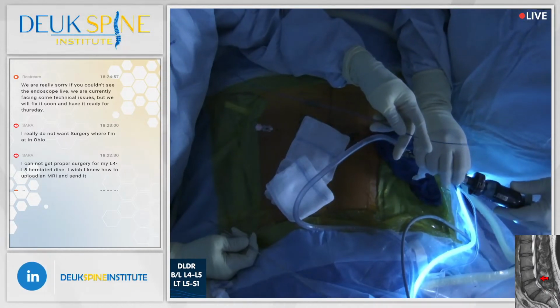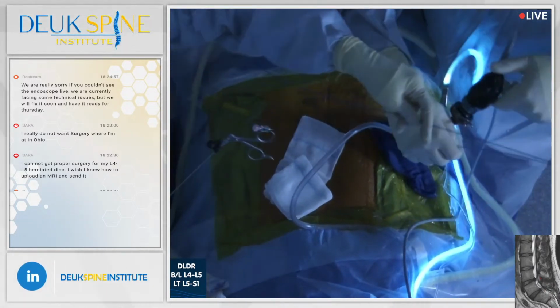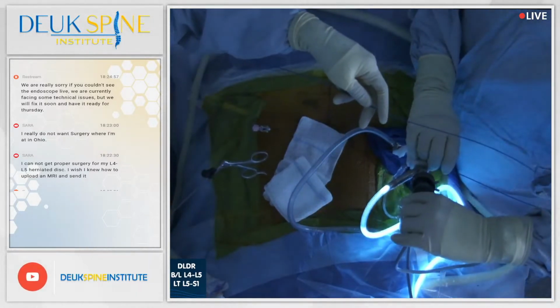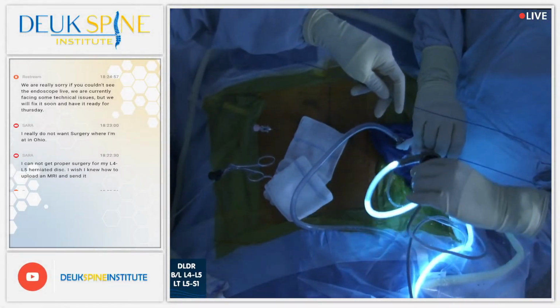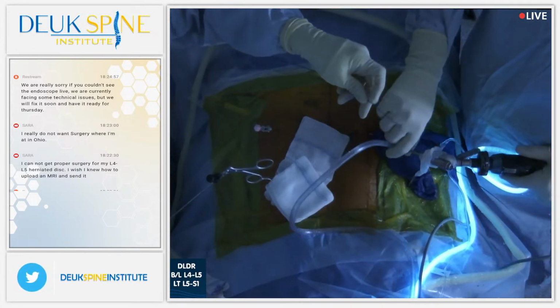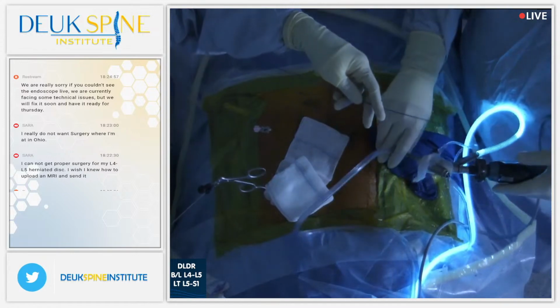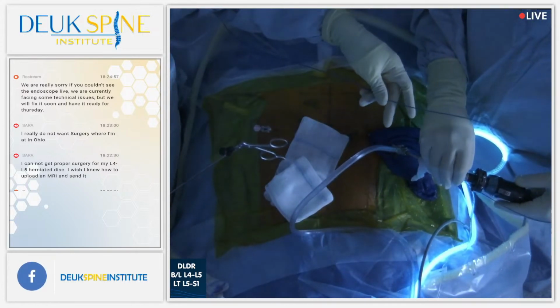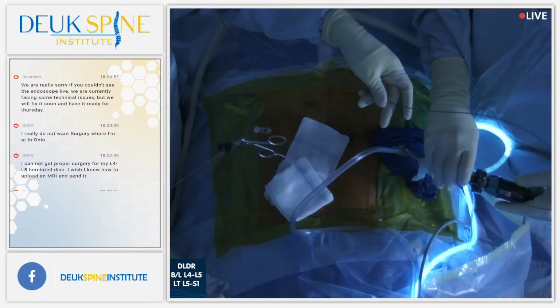All right. I think that's about it. All right, we're going to go do the other one and we'll be done. No DPRs this one, right? Looks good, about 3 millimeter hole. See that, Luis? Oh yeah.